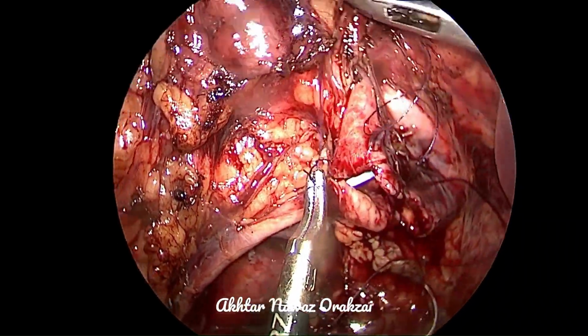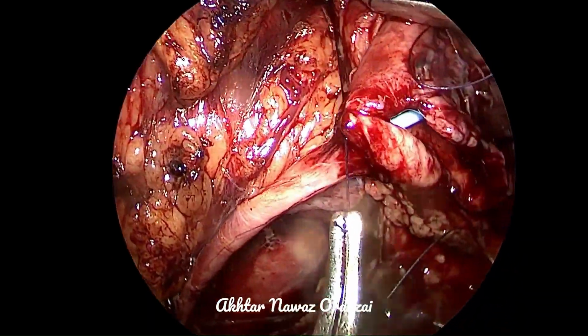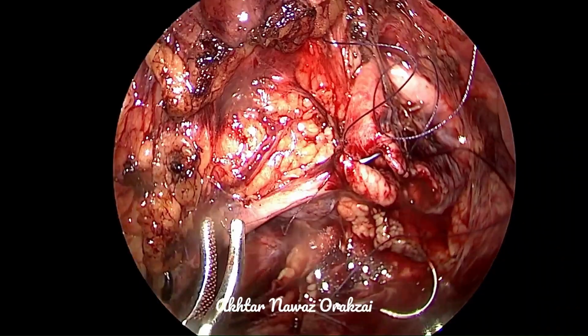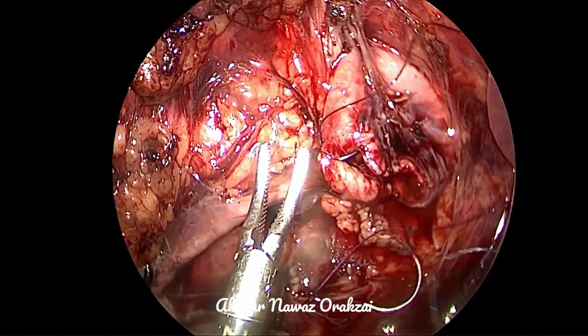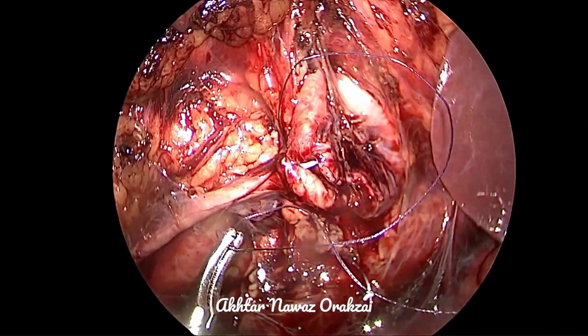And for that watertightness, I keep the catheter for a minimum of 1 week, or preferably 10 days if possible. Of course, prolonged catheterization has got its own demerits.